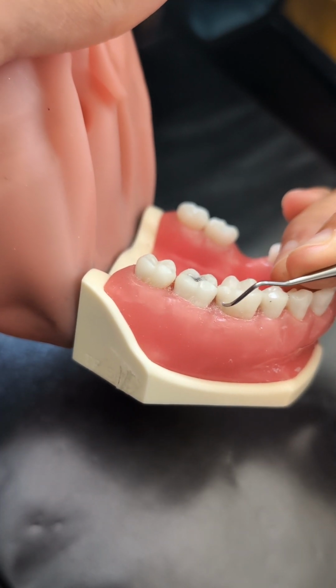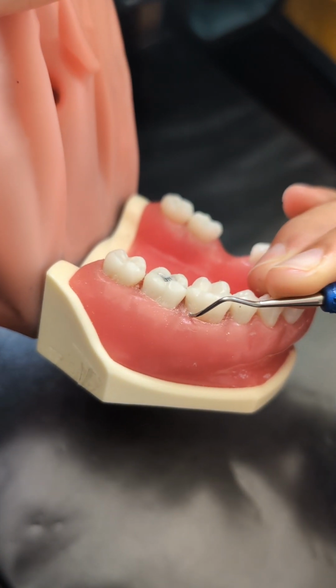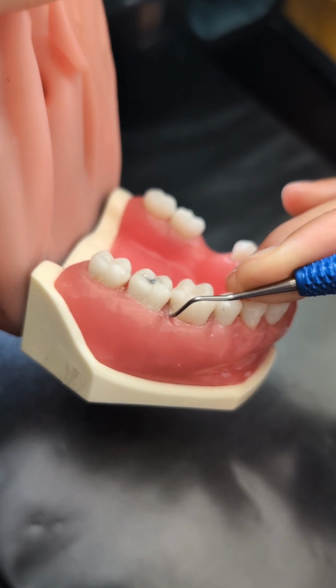We're going to close 0 to 40 degrees. We're going to insert, and we're going to open. We close so we avoid tissue laceration. Close, insert, open, and we instrument.